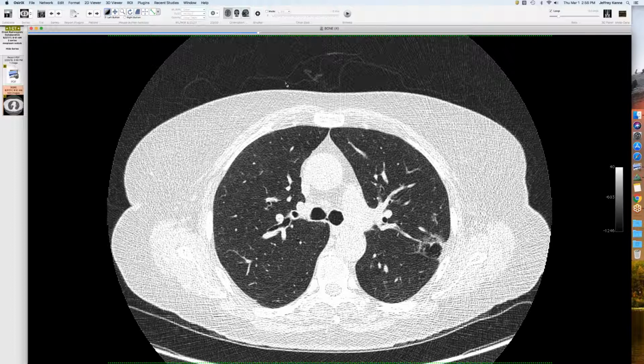So, yeah, the 4X is an interesting topic, and there was a really nice study published from the Netherlands where they looked at the NLST data, and they had 6 chest radiologists go back and score certain cancers from there. The conclusion was that if the radiologist called it 4X, it almost always was cancer, and the one that wasn't looked like cancer anyway. So it's sort of that undefined entity, the gestalt or gut or whatever you want to call it.